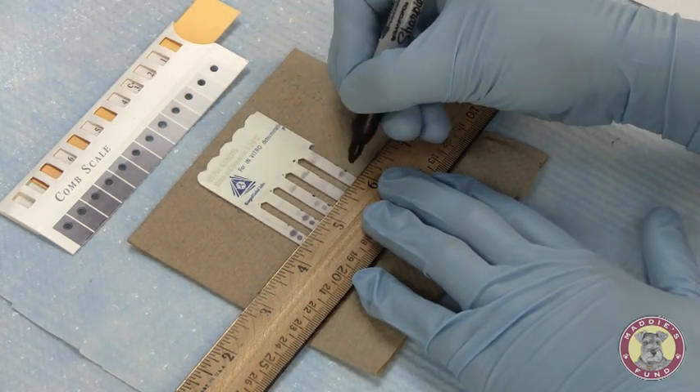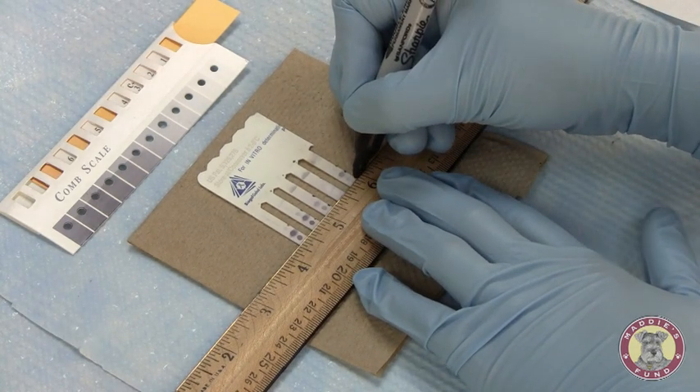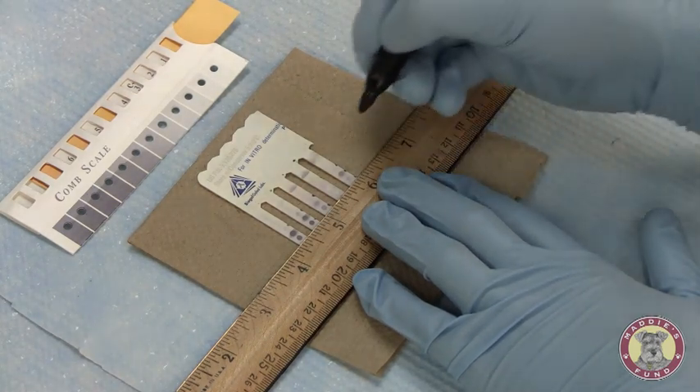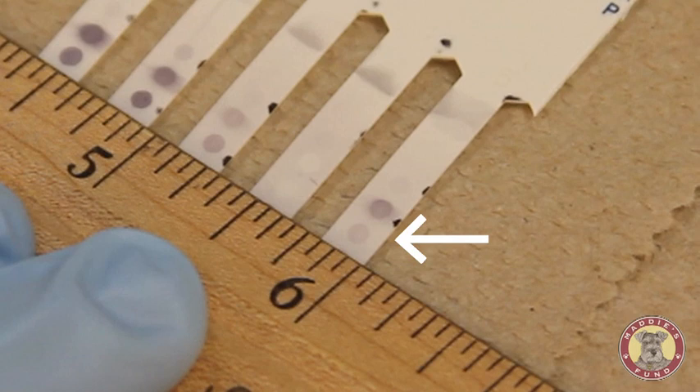Last sample, sample 5 — the color development that has taken place is slightly darker than our positive control. Our positive control is measuring at a 3, so we will call this circle a 4.